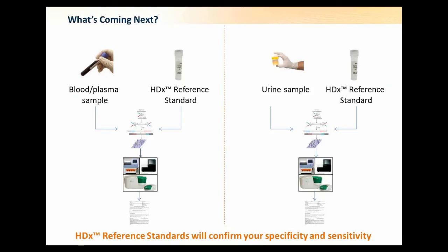So, some of our take-home messages, and also some things we're very excited about. First of all, as Jonathan was saying, it is critical that cell-free DNA assays are routinely validated to ensure accurate, precise, and robust reporting. I hope I could convince you that highly validated reference standards are required to support assay monitoring and development.